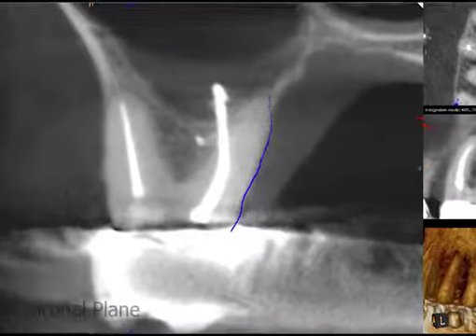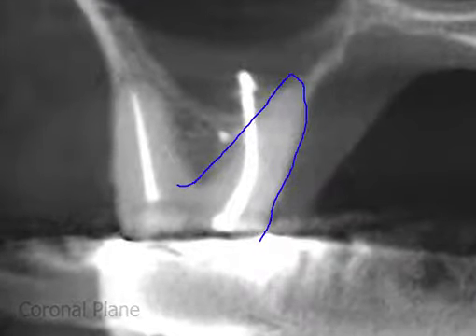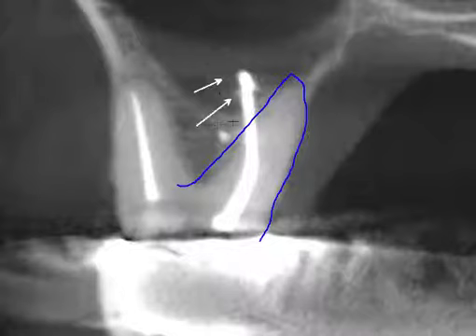On the axial plane of the cone beam scan, the outline of the palatal root can be seen in blue, and the white arrow indicates the point of the perforation. In the coronal plane, again the palatal root is outlined in blue, and the extruded gutta-percha can be seen, indicated by the white arrows. The bottom of the sinus cavity is indicated in orange.